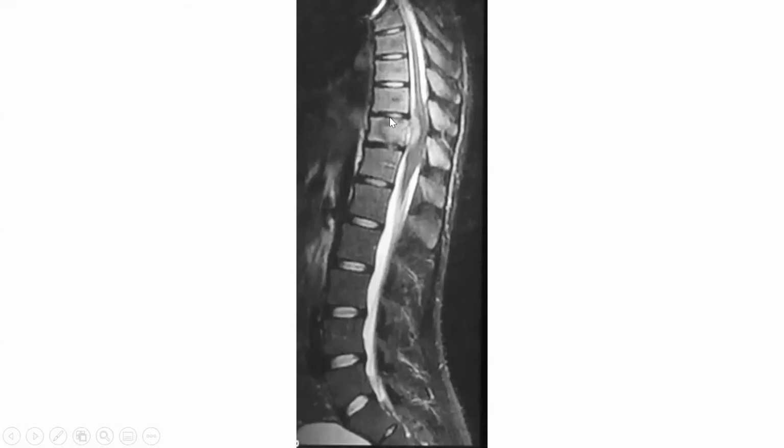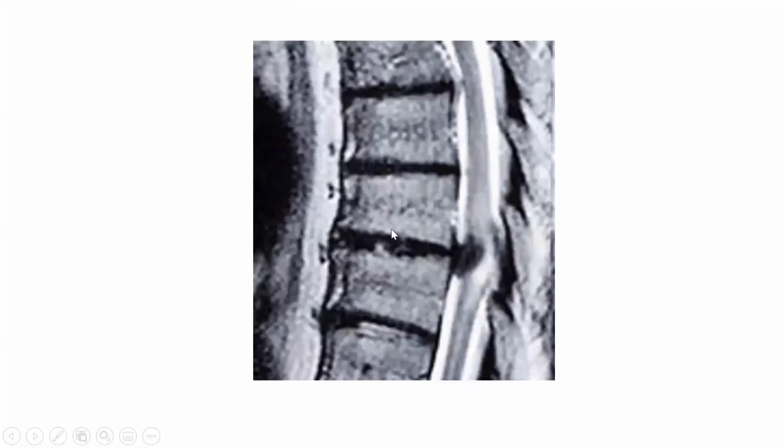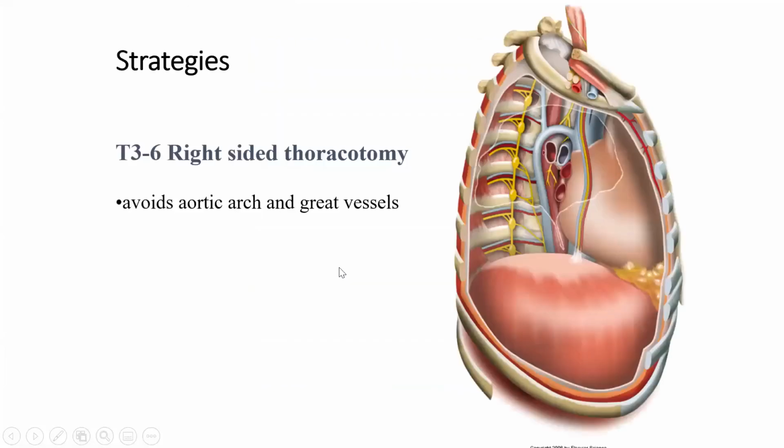There's a patient with this. This is an osteosarcoma, single body involvement, leaving the disc intact, eroded into the canal. This is a patient with a thoracic disc osteophyte complex, gone into the cord. Obviously a very old MRI scan, there's some cord signal there.